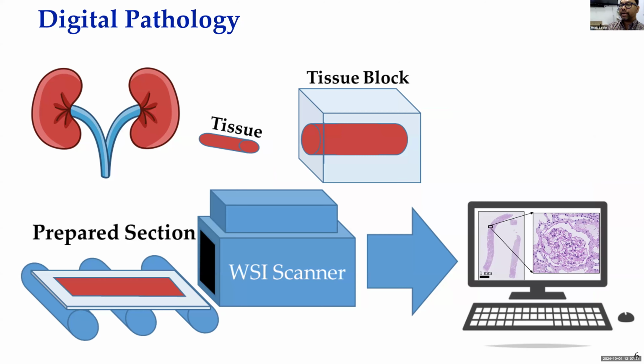So that being said, what is digital pathology? Whatever I just said is the very traditional way, when someone puts a tissue sample after staining underneath the microscope, they look into that, and pathologists and clinicians diagnose by looking at the tissue, right?